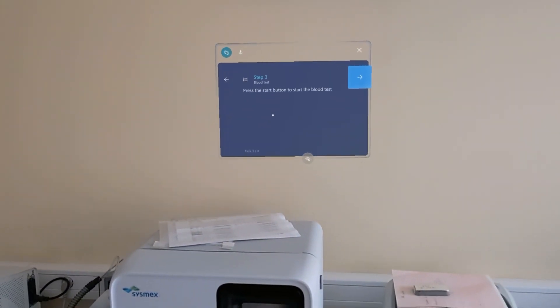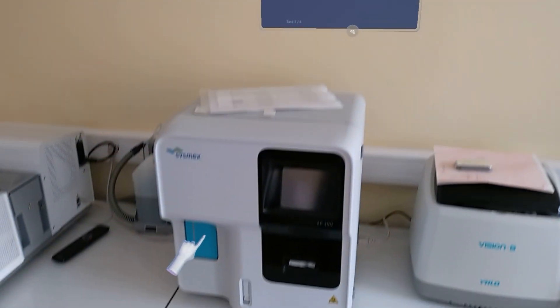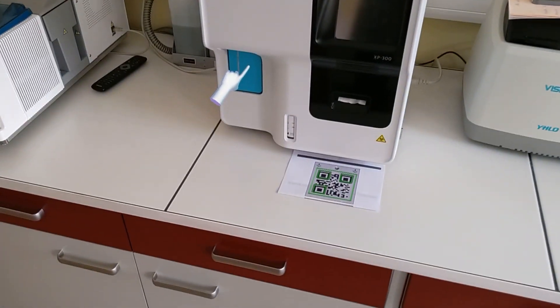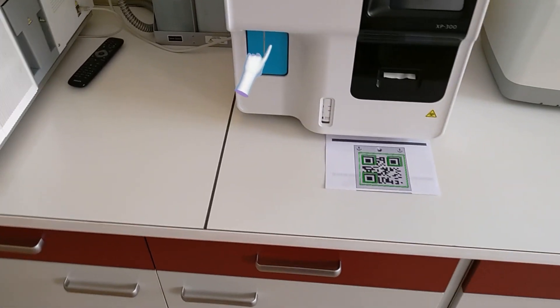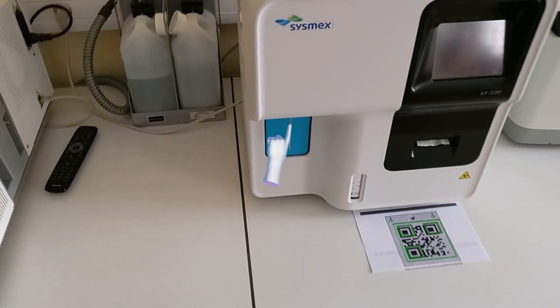The next step is to start the blood test by pressing the start button.